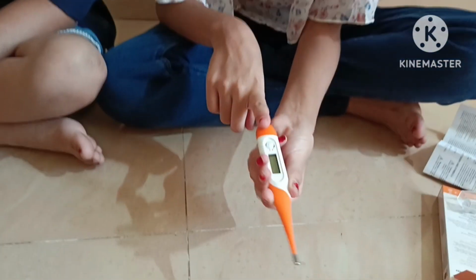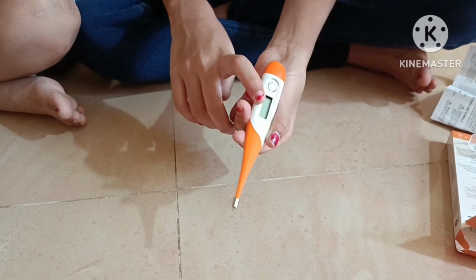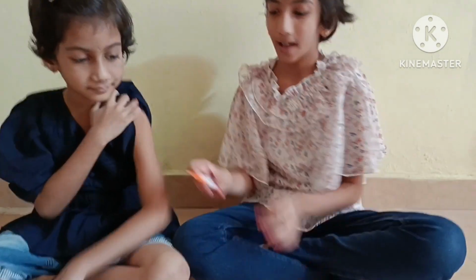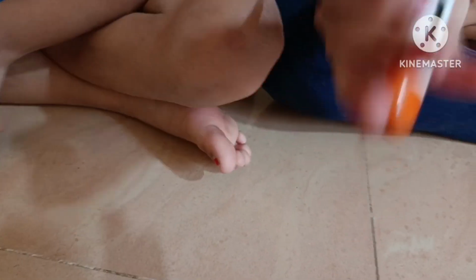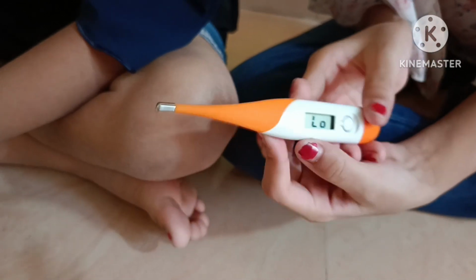This is battery cap and this screen is called LCD. And this one is called probe. Now let's check the temperature of Nitya. When we on the thermometer, L0 should come. Then we can keep it.